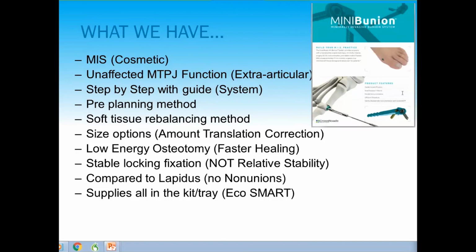There is a kind of step off on the medial side where you did the bone cut of the osteotomy on the proximal piece, and that can be shaven down so it's not medially prominent right along the medial aspect where the insertion of the mini-bunion plate and screws are.